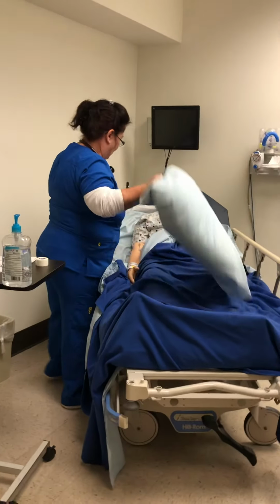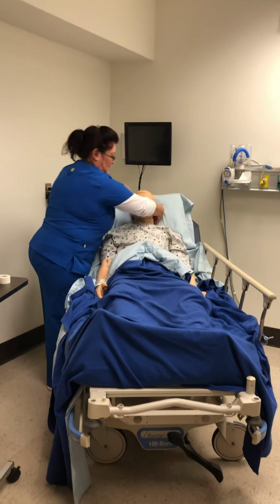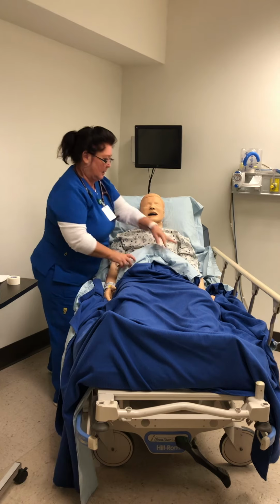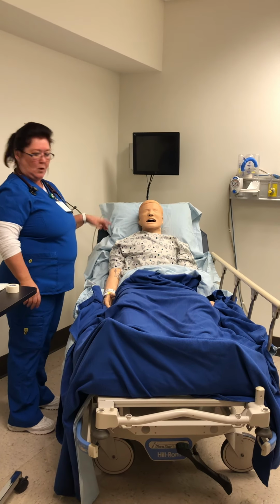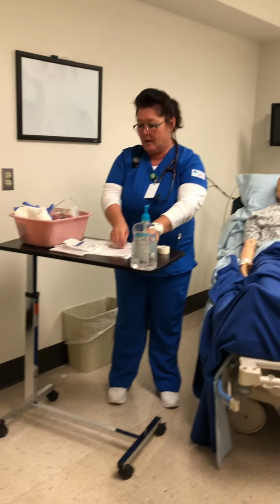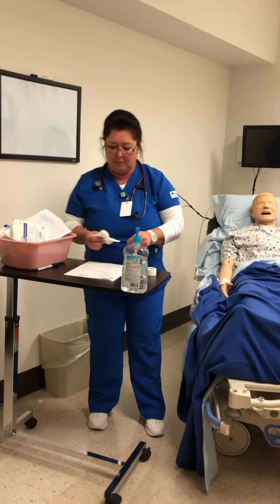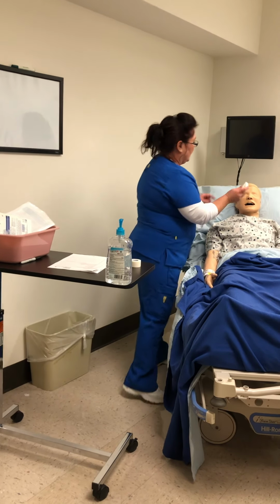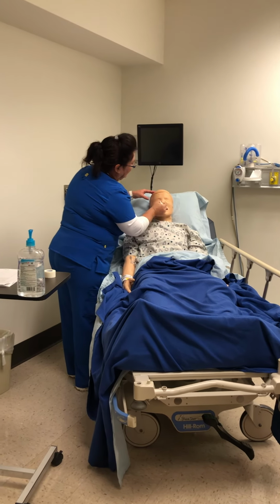Okay, I'm going to give Shirley back her pillow. And Shirley has no more questions, so I am going to do my aftercare of the room, cleaning everything up. And I am going to wipe the inside of Shirley's nose. Make sure we get everything out of it.